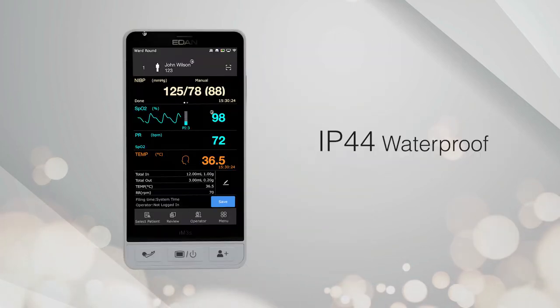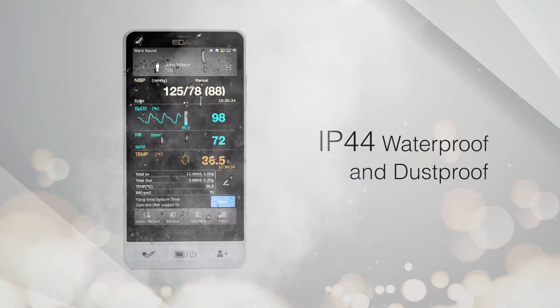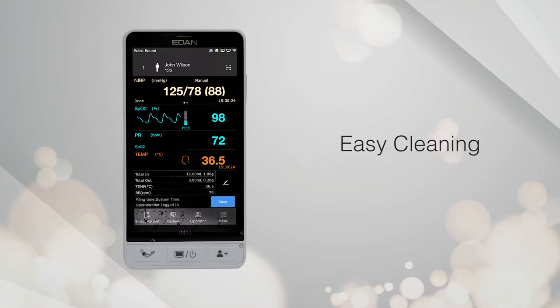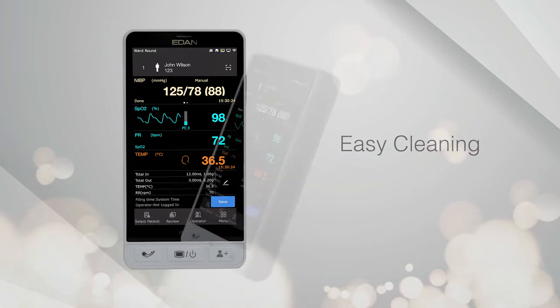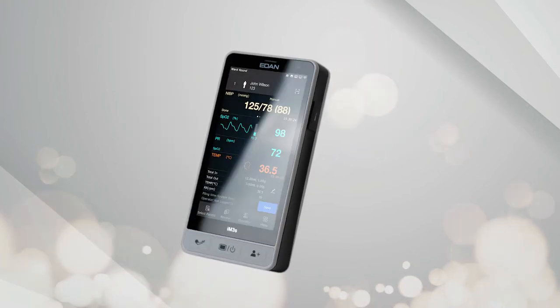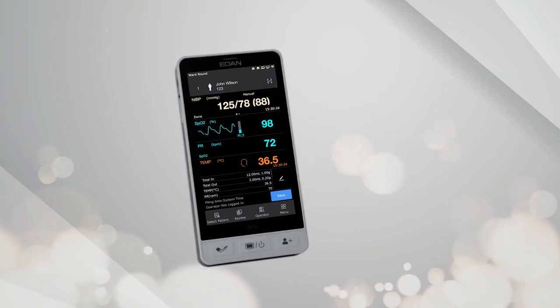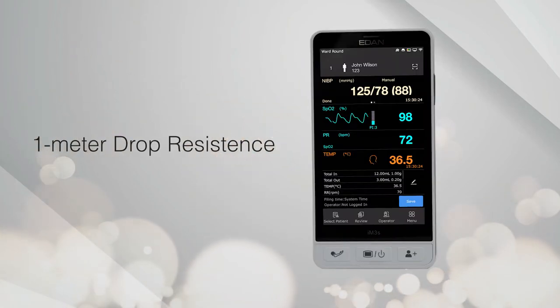Being IP44 waterproof and dustproof, the device is well protected while facilitating safe cleaning and sanitation. The sturdy design of the IM3S will minimize damage from accidental falls or drops from up to a height of 1 meter.